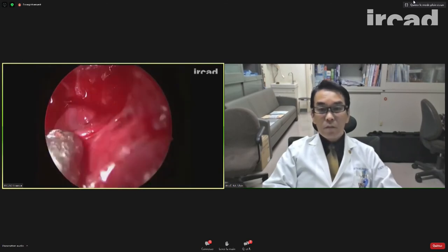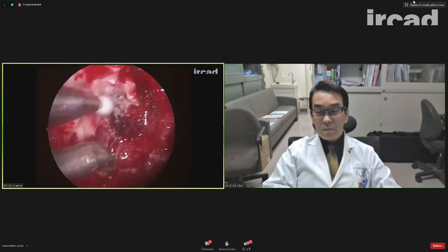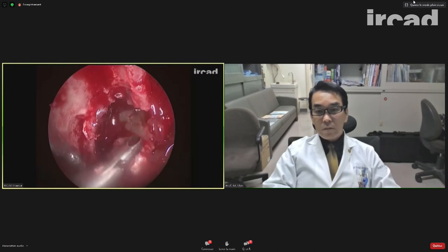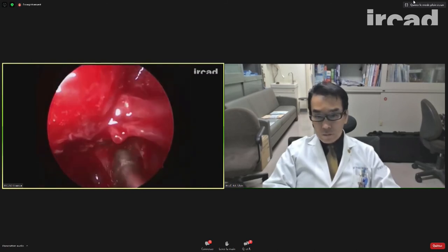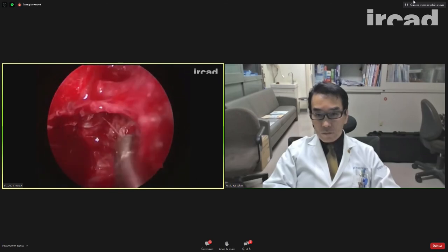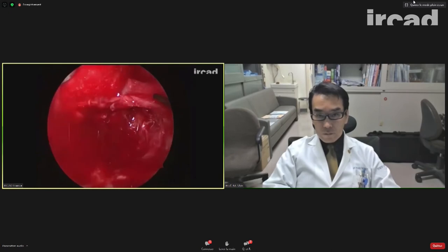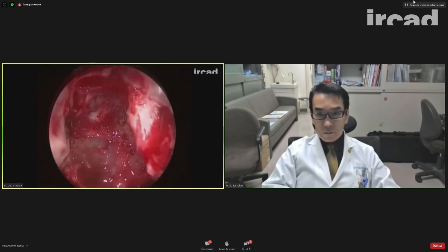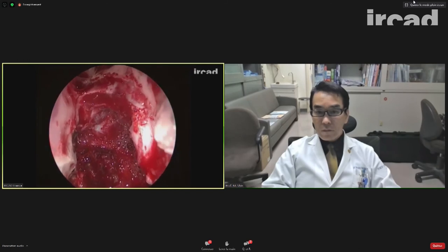Here is a resection. We see some arachnoid. Here is on the other side, because when you have a big extension on one side in the cavernous sinus, you should not forget that there is also another side. Sometimes you focus on the biggest part, but you forget that there is a small remnant on the opposite side. So we focused on the clivus also.